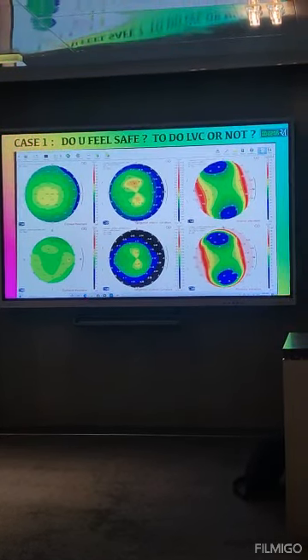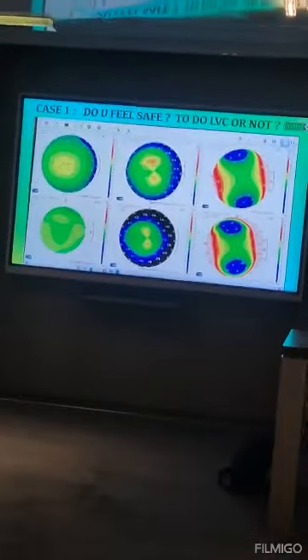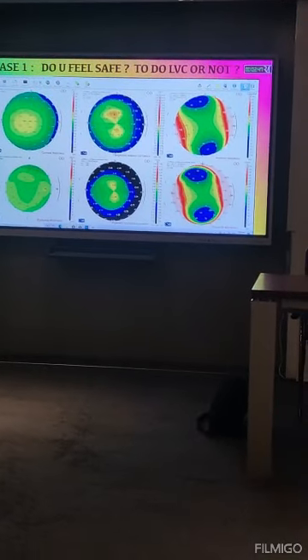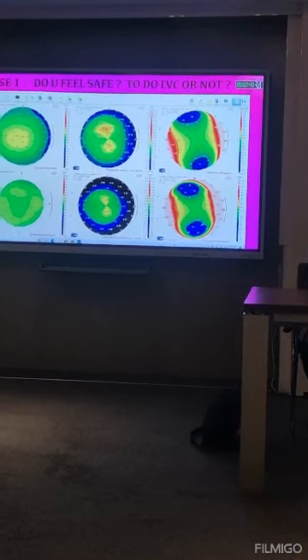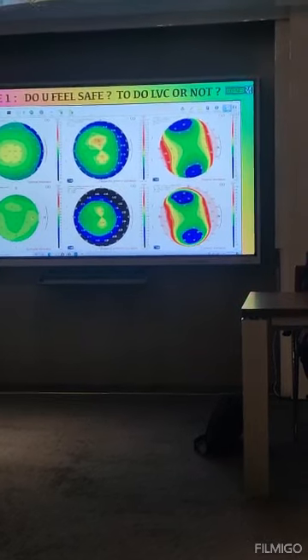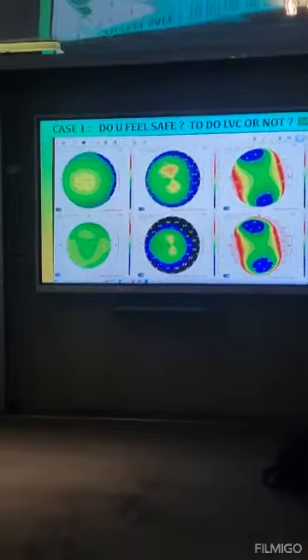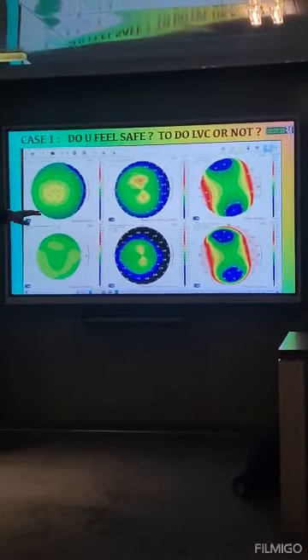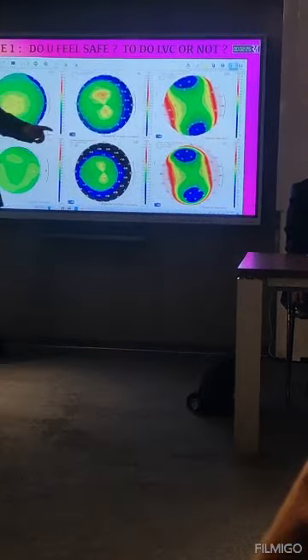But do you believe in superior keratoconus or not? Very rare. I don't diagnose it unless I have clear evidence that this is a superior keratoconus. It does exist, but it's not that common. What about the back curvature map? The posterior curvature is good. The elevation maps are not bad here. Also the posterior elevation looks normal. And finally, the epithelial thickness.